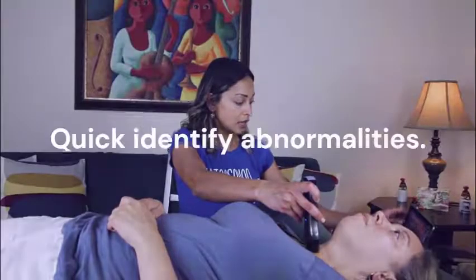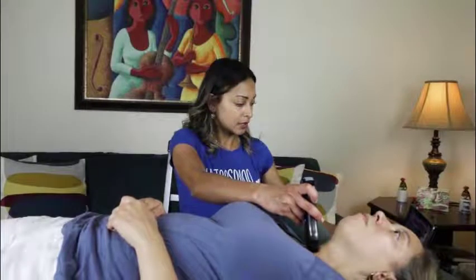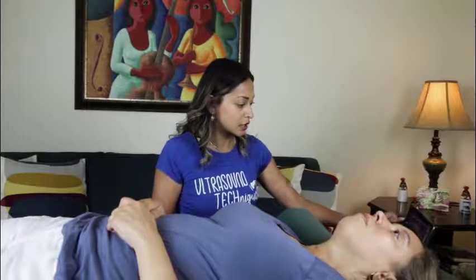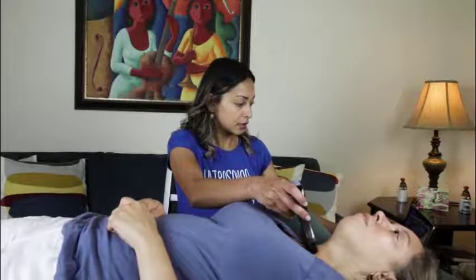So this patient has a known thyroid nodule. So it picks it up really, really nicely right there. I can see the borders. If I wanted to measure, I can measure. I'm actually just going to zoom out a little bit so that it's a little clearer. Here we go. I actually just froze it using the screen.